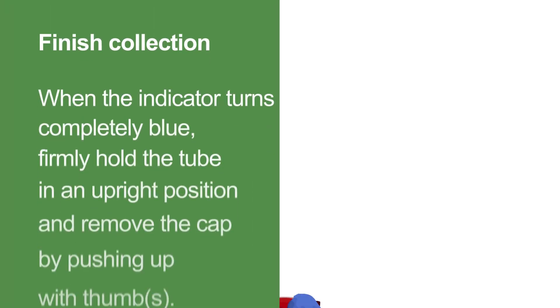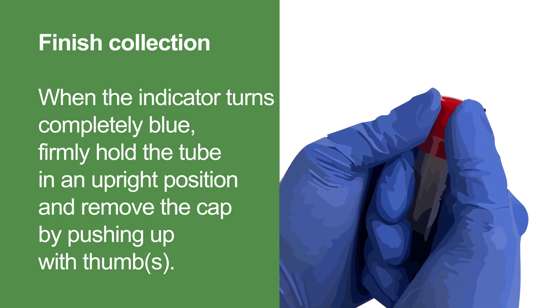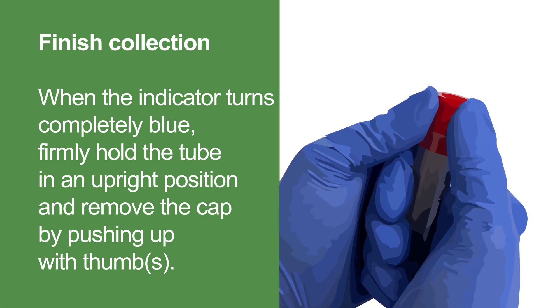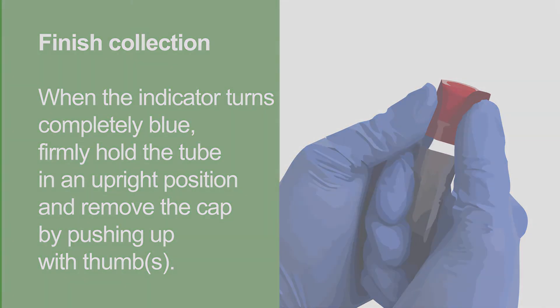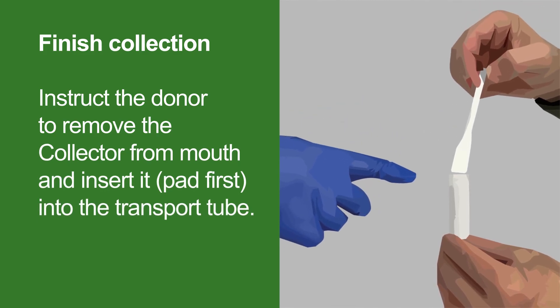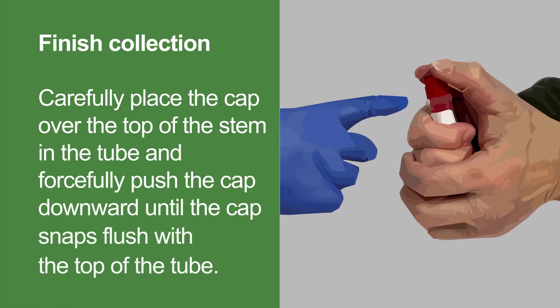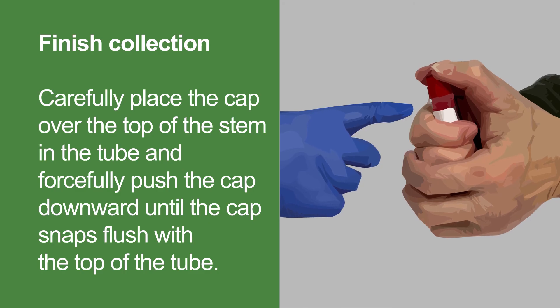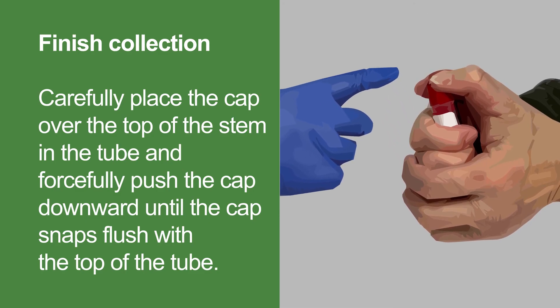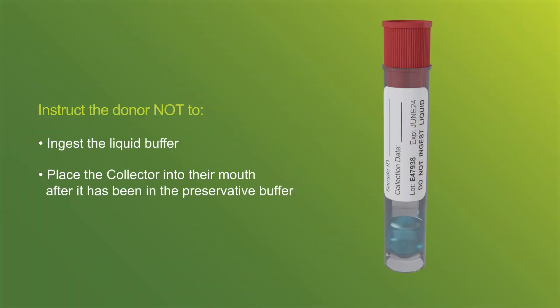After the indicator has turned blue, firmly hold the transport tube upright. Remove the red cap by pushing up with the thumb, ensuring the liquid inside the transport tube does not spill. Instruct the donor to remove the collection device from their mouth and insert it pad first into the transport tube. Then carefully place the red cap over the stem in the tube and forcefully push the cap down until the cap snaps flush with the top of the tube. Be careful the donor does not ingest the liquid buffer or place the collection device back into their mouth after it has been in the preservative buffer.